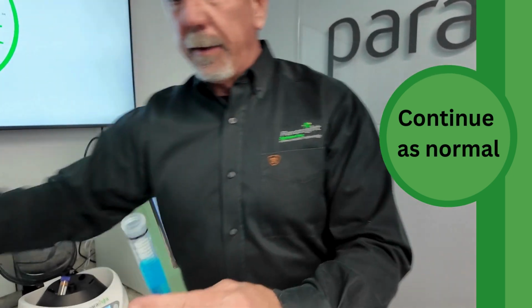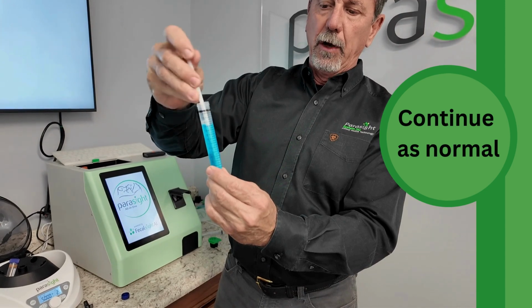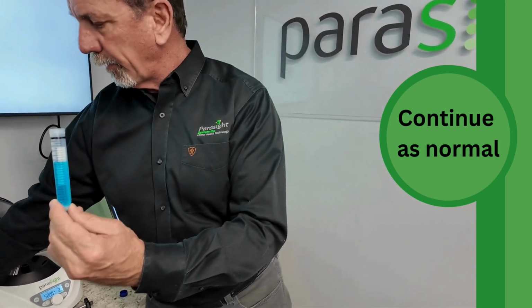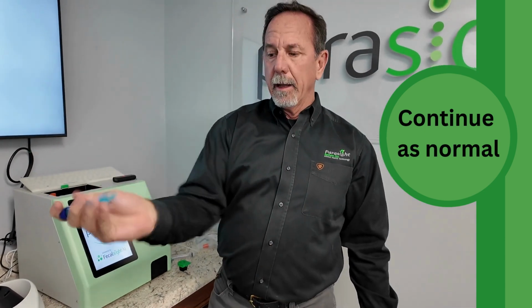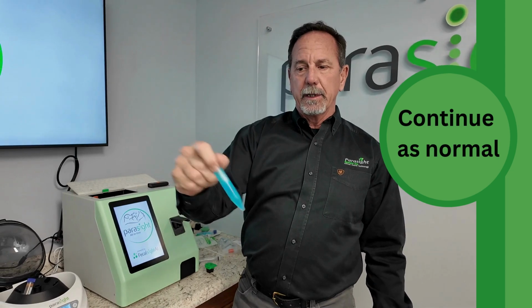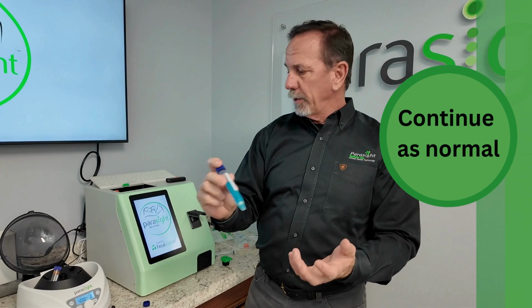So again, we have that amount in there. We're going to go ahead and take something to agitate the plug at the bottom there. So we'll go down, we can take a fecal loop or anything that's thin to be able to agitate that to get that to go free. Then you're going to go ahead and take this on top, and then we're going to mix vigorously. Sometimes that ball will stick on the bottom. You can just go ahead and get it to go back and forth so you see it to be able to do this. And then we're going to continue the test just like what we normally would.